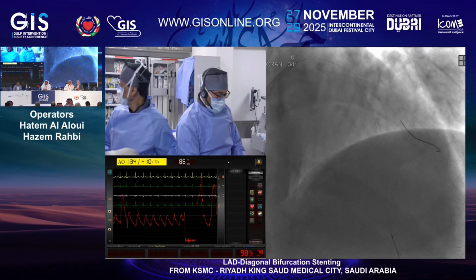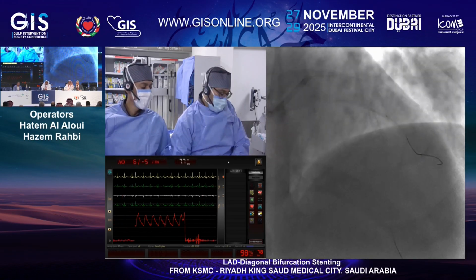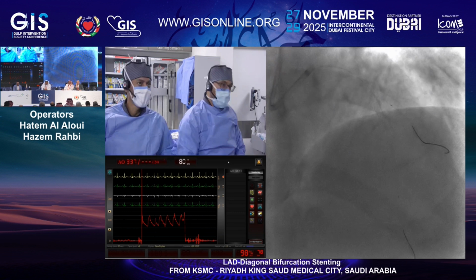3.5, 15. Careful, balloon. You don't want to do imaging now, just before? Maybe you don't need anything else.